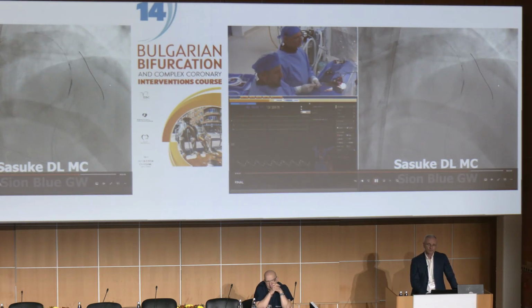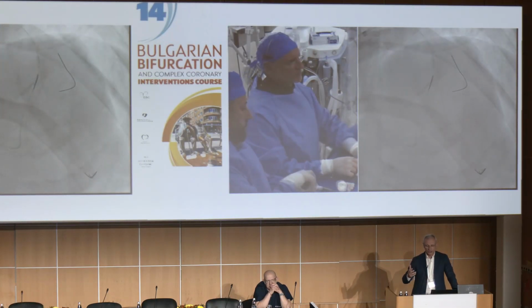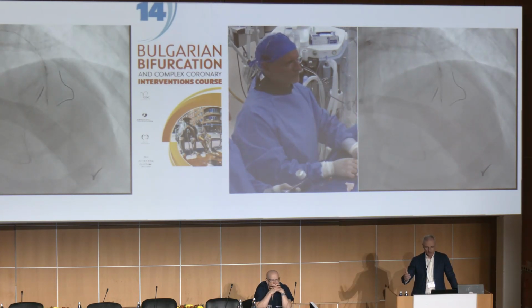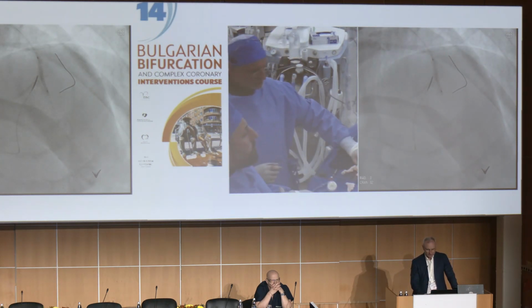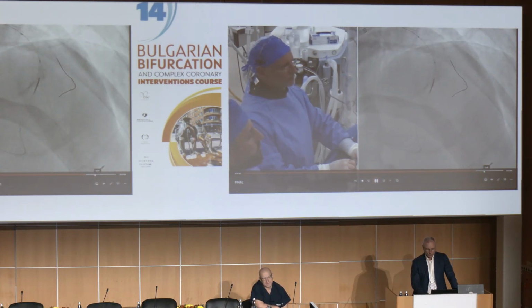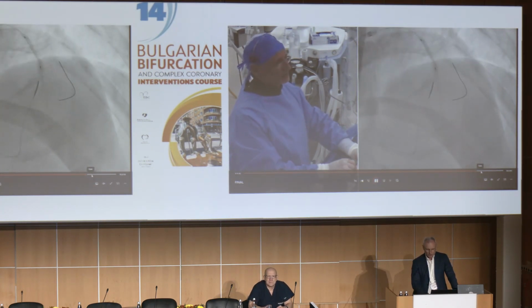So you saw all these continuous steps of procedural planning: antegrade, retrograde, puncture of the proximal cap, puncture of the distal cap, and all of the details of trapping and externalization that are necessary in this kind of procedure. And I'm coming to an end because the program is going to be extremely interesting for the next microvascular assessment with physiology. We did the predilatation.